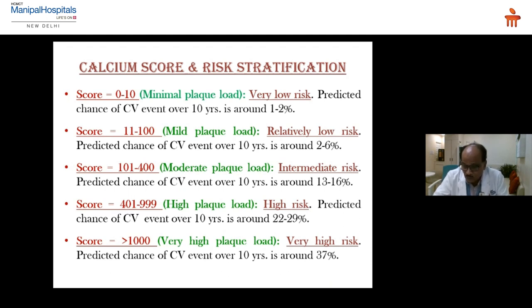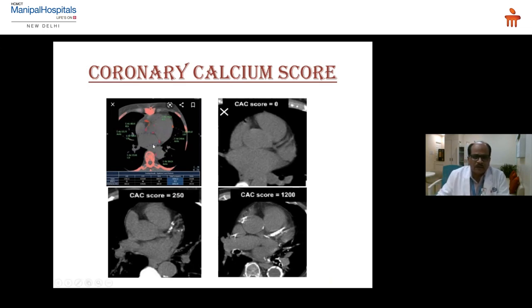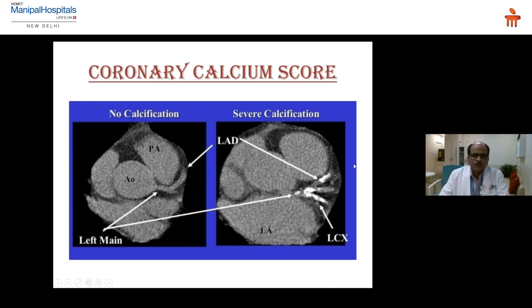This is how we verify risk factors and calculate the calcium score. On the left side you can see how we take the various calcium deposits — the summation gives the total calcium score. A score of zero is absolutely free of disease. Around 250 score shows focal calcification. Above 1200 shows diffuse, dense calcifications on the coronary arteries. Here is a normal left main and LAD, and here we have dense diffuse calcifications.